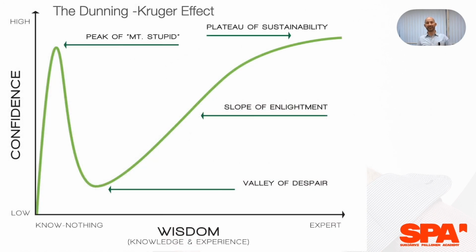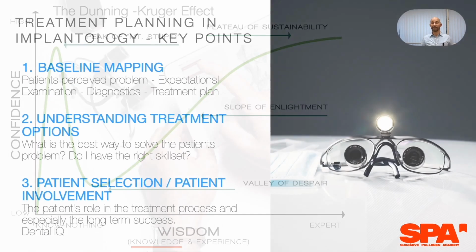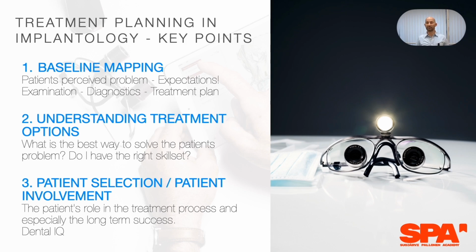And digital dentistry is making the prosthetic steps especially very easy, and the development on the implant placement protocols has also gone forward. Implantology is in a way straightforward when you're thinking only of the procedures. The one thing that is hard is to know enough of where the risks are and how to manage them. And that's the key. That's the key in treatment planning: risk management and knowing the risks. In order to do that, we'll need to have a proper baseline mapping.